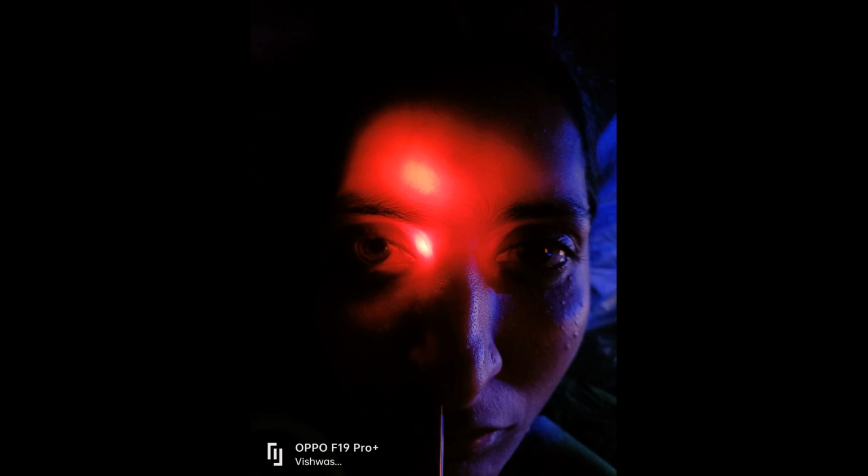So that's the external photograph of the patient on day 15 itself after the thorough nasal wash. And as you can see, that's the patient's right side frontal sinus, and we can appreciate a bright reddish hue, a very, very large hue of the frontal sinus glow, and that indicates that the patient is completely free of fungus inside. And we had already seen on the CT scan in the original surgical video that this patient had a very, very huge right side frontal sinus. You can see the frontal sinus is also extending onto the left side, and the left side frontal sinus is very small.